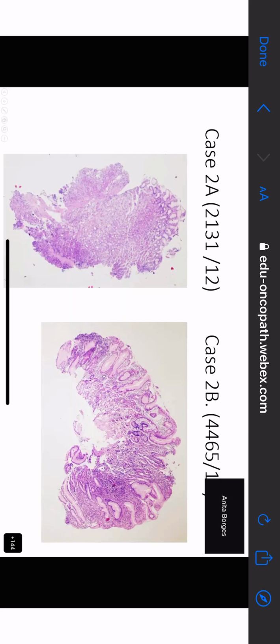Okay, and then you don't see any oxyntic type epithelium. Oxyntic means that it should have parietal cells and chief cells. At least parietal cells should be there. And these are mucus secreting glands. The glands are as long as the gastric foveolar epithelium, which reaches down into the pits. What else do you see?